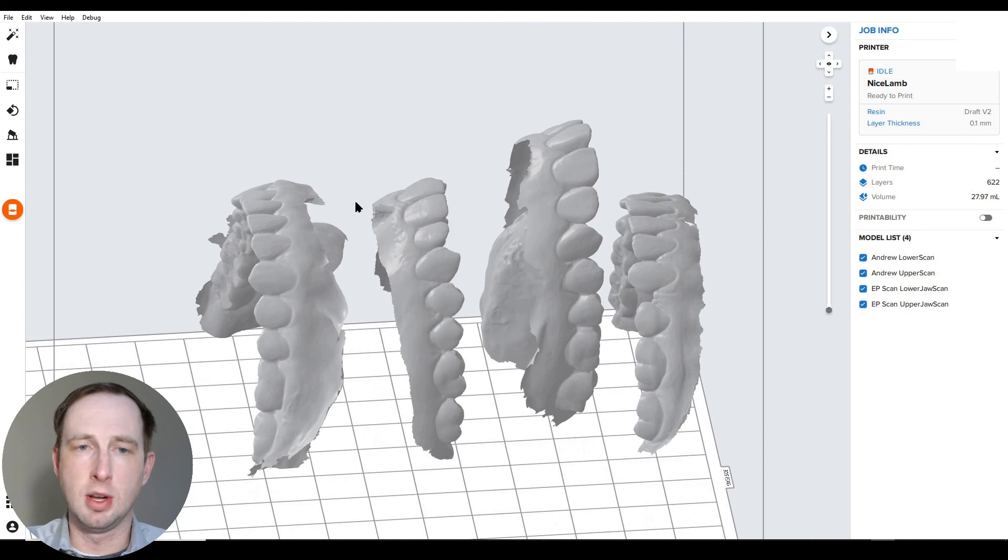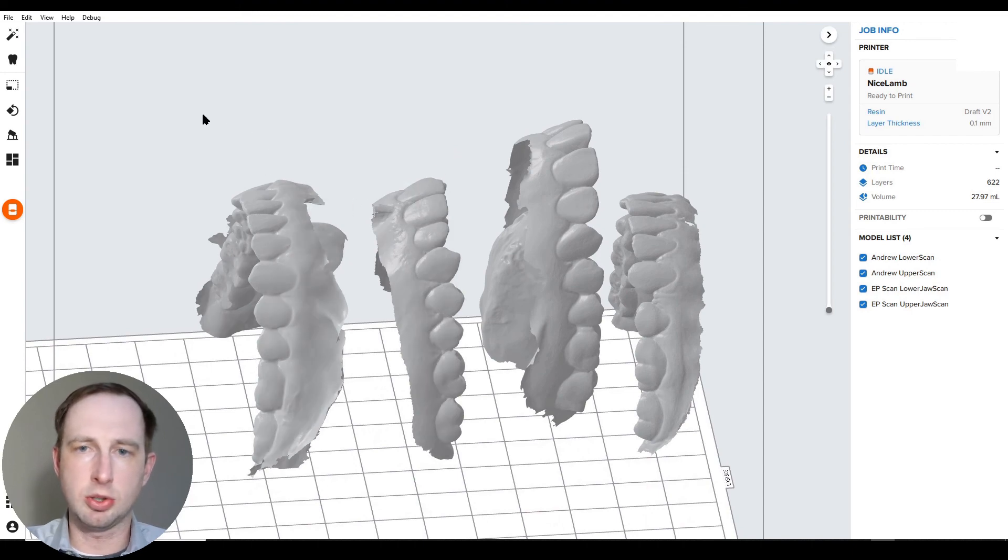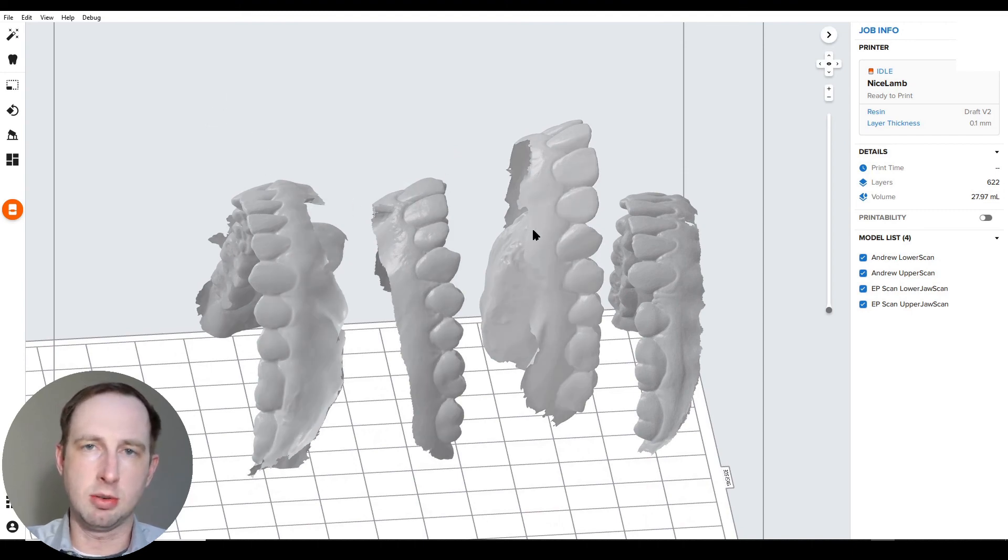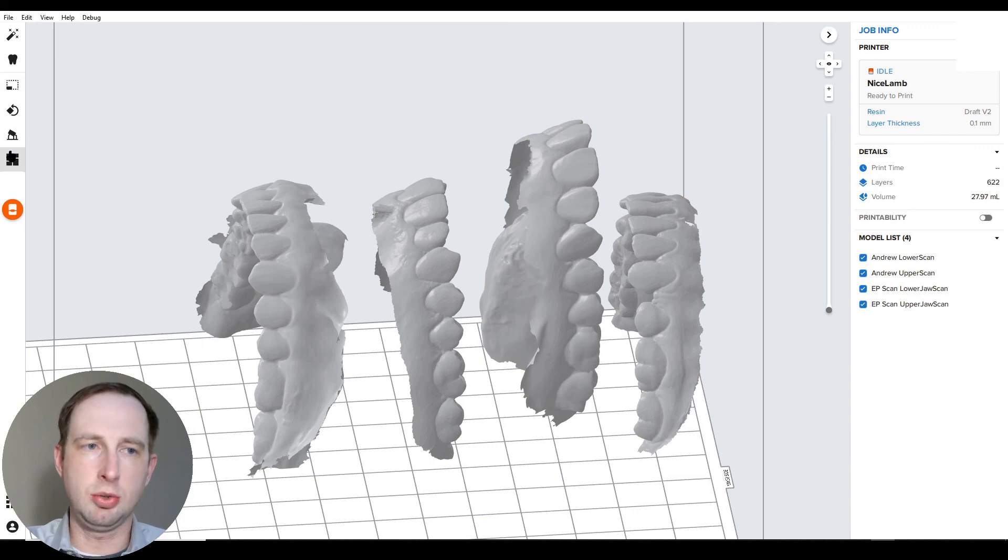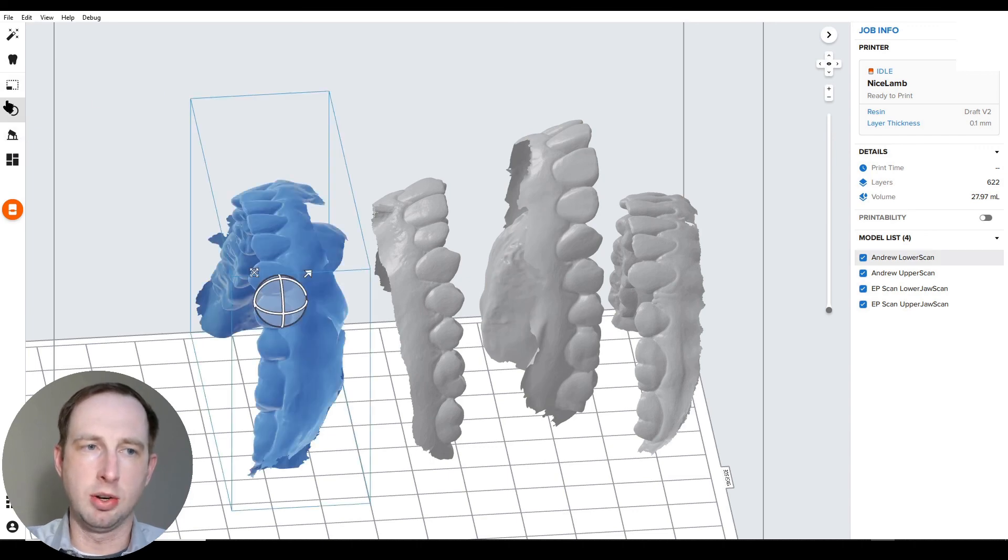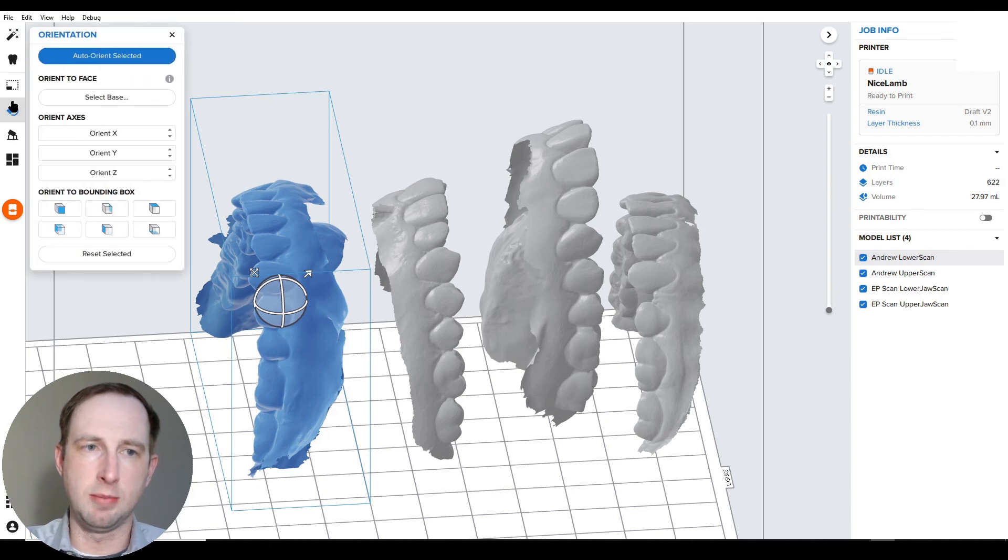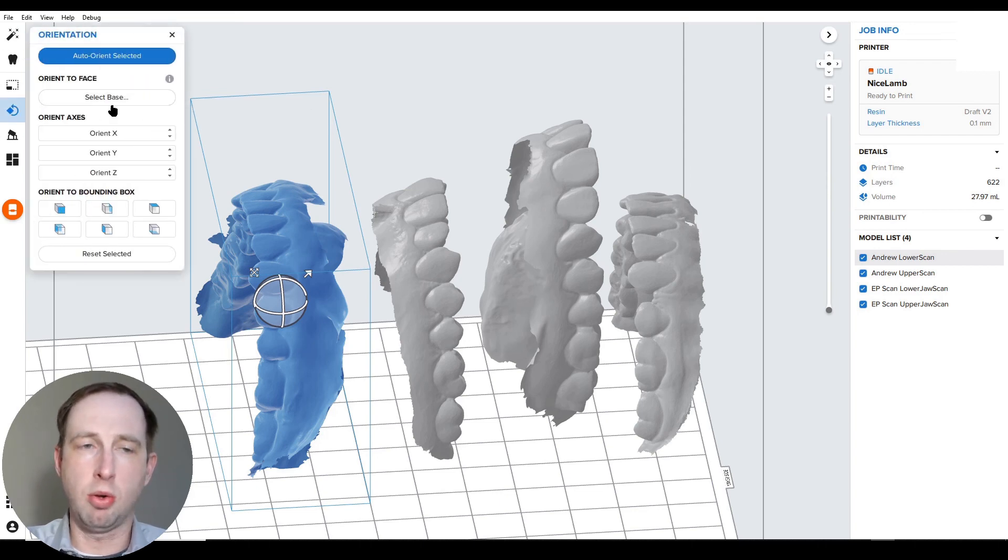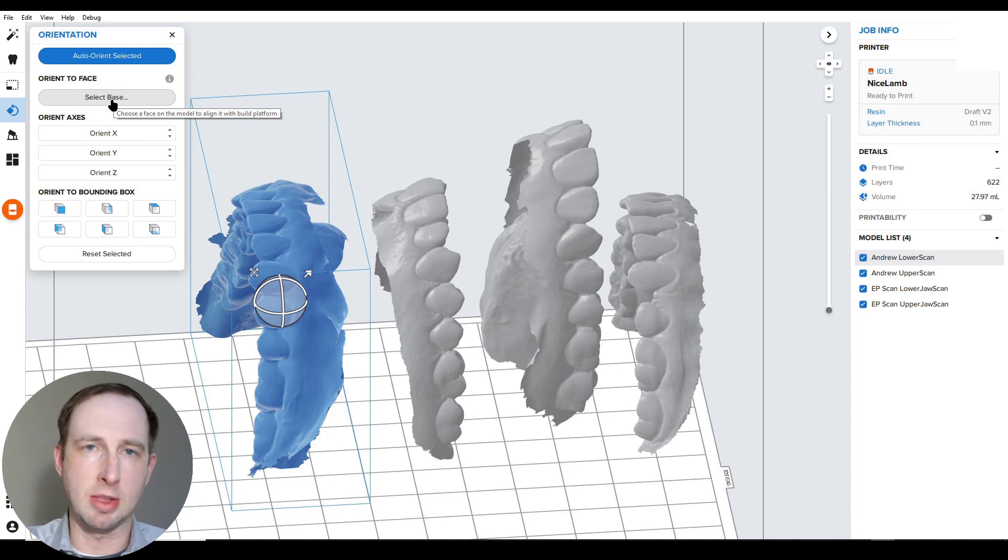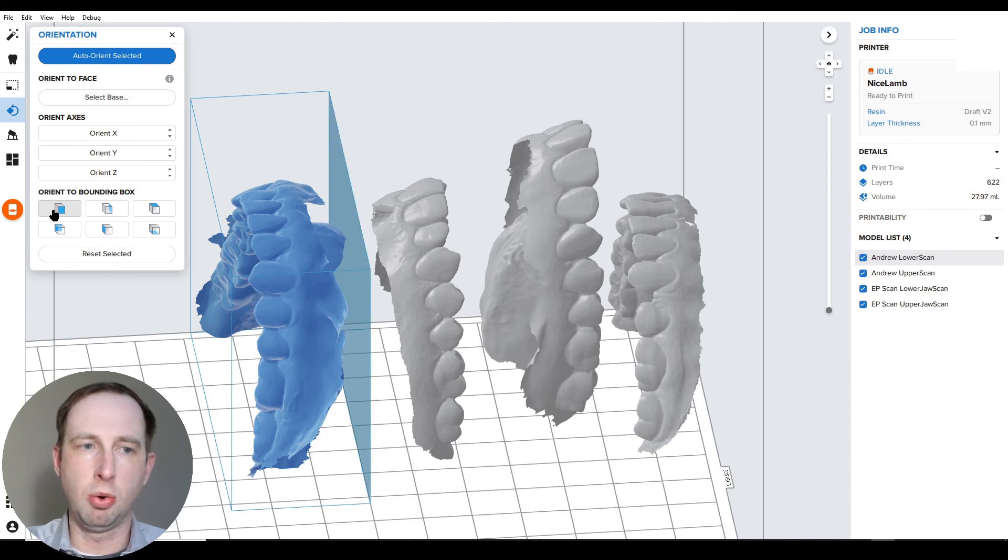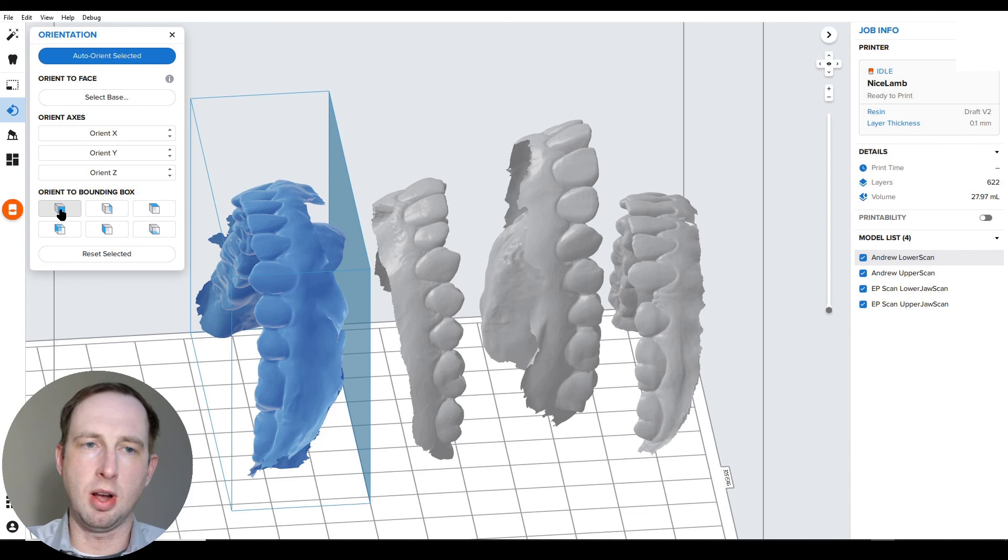Let me turn them all back on. So when your files are in, the easiest way, especially using this workflow to get them into the right orientation, is actually using this button under orientation tool. If you look over here on the left, you hit this button, and I use this button all the time for select base and snapping things down to the build platform.